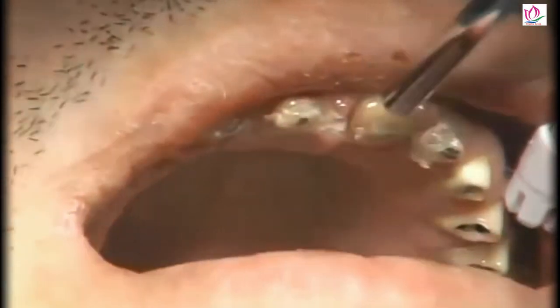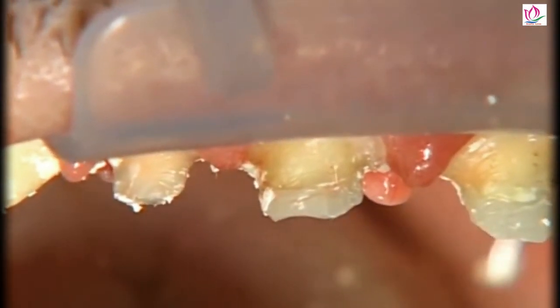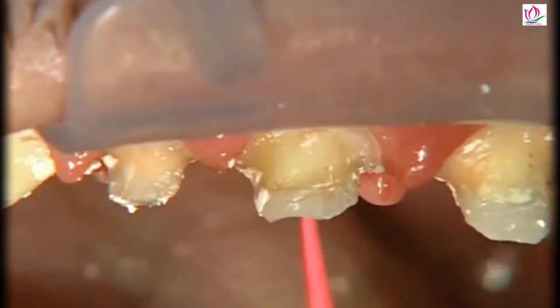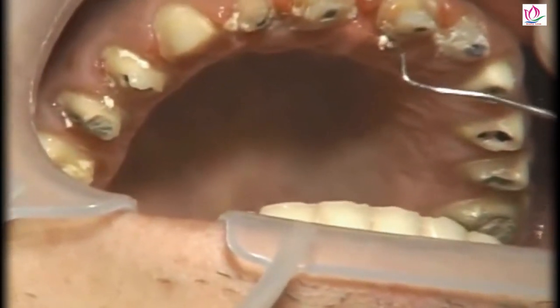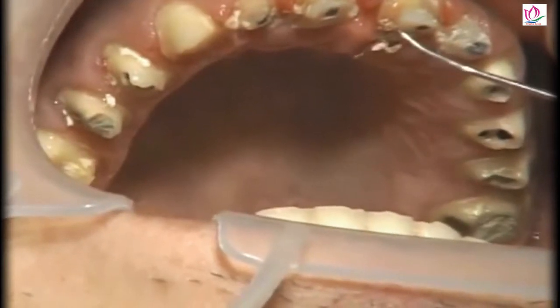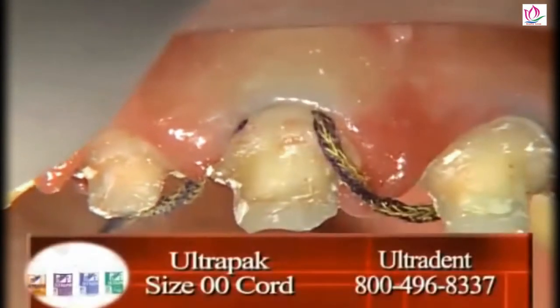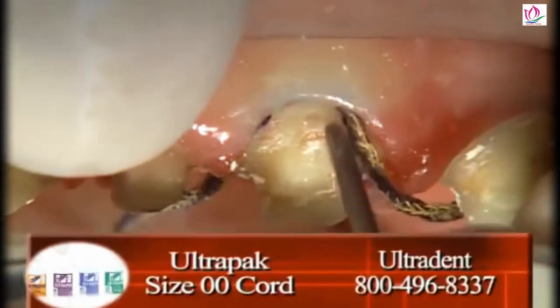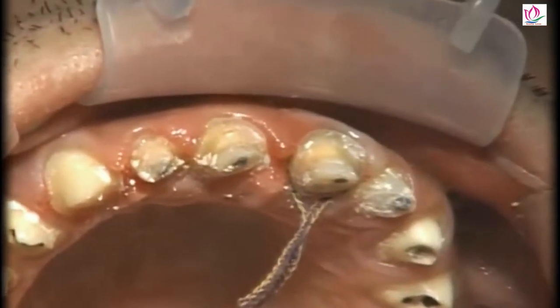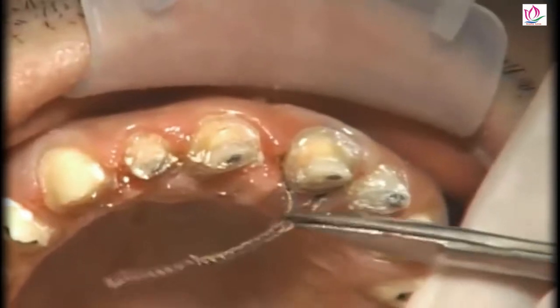About ten days later we have the patient back. At this appointment we're going to take a look and see how everything looks and plan on taking the master impression. The main point is that it's really difficult to get great restorative results, especially in the anterior, if you take your master impression on the same day that you prepare. The best approach is to prepare the teeth on the first appointment, get the temporaries on, then bring the patient back to take the temporaries off, make sure your margins are still where you want them, and drop any margins down if needed to sit half a millimeter subgingival. When you put the temporaries back on, there will be no change because the tissue is in a stable position.